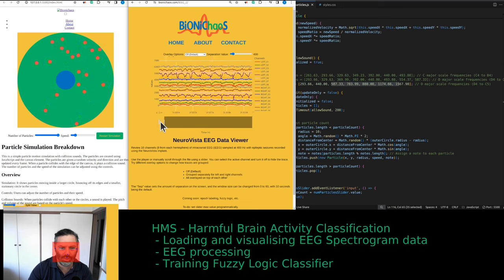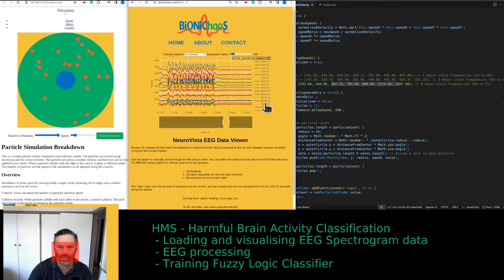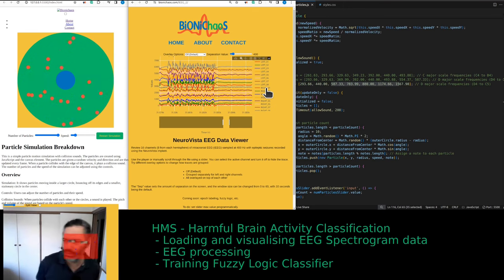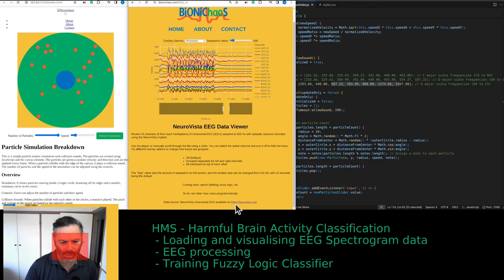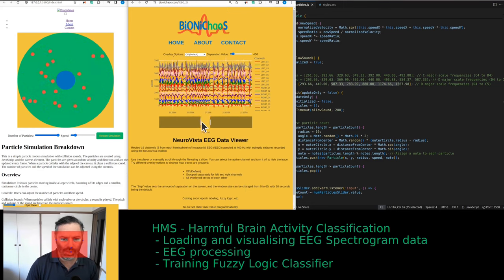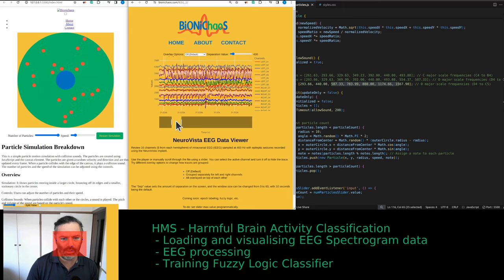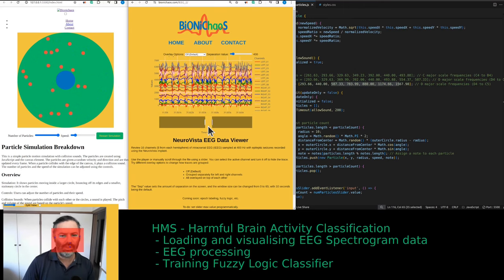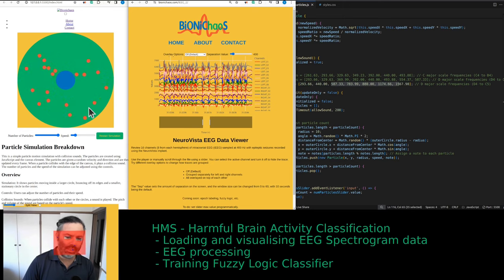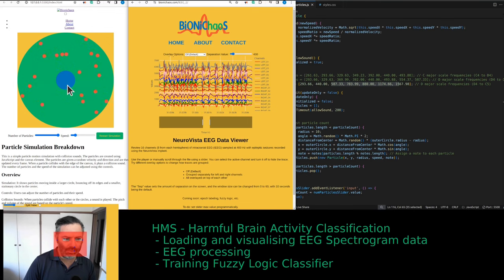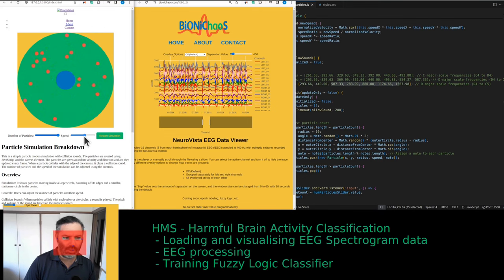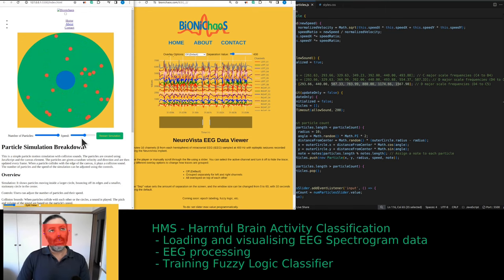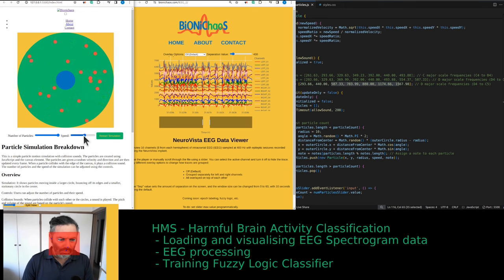This is a seizure — an evolution of a seizure — then quiet after it ends. These are 16 implanted channels available in the public domain on IEG.org. With a simple registration, you can get the data. There was an older Kaggle competition using that data. When you have a seizure, the frequency goes up, so the speed can go up like that.